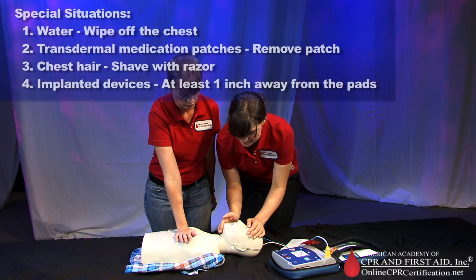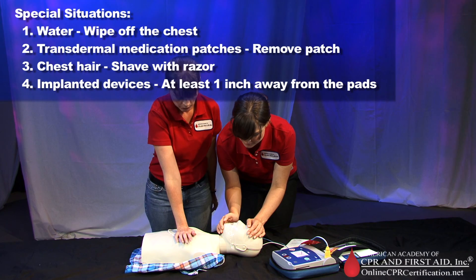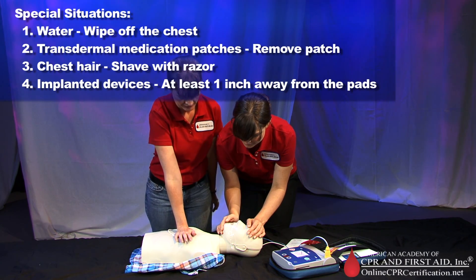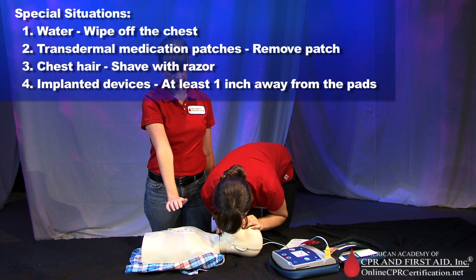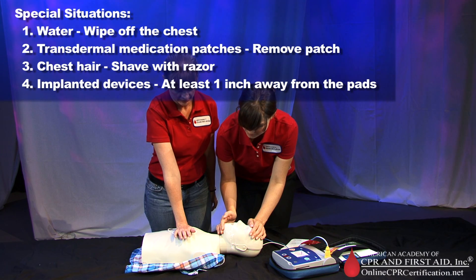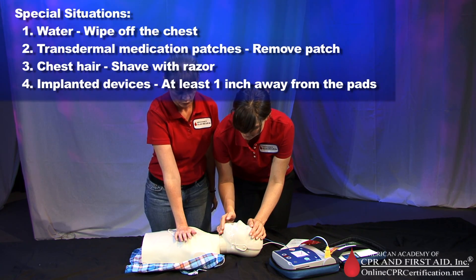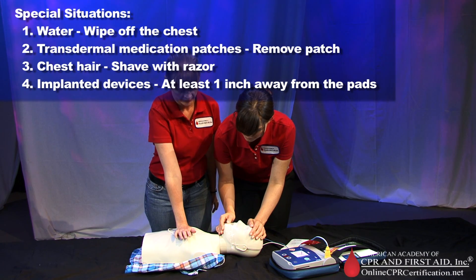In special situations: if there is water on the victim, wipe off the chest. If there is a transdermal medication patch, remove the patch. If the victim has a lot of chest hair, shave with a razor and use new pads. If the victim has implanted devices, the pads must be at least one inch away from these devices — do not place the pad directly over the device.